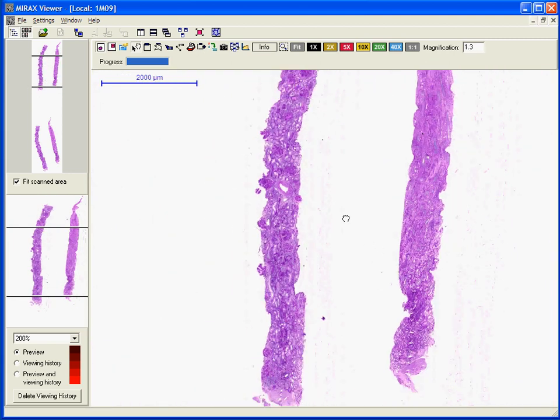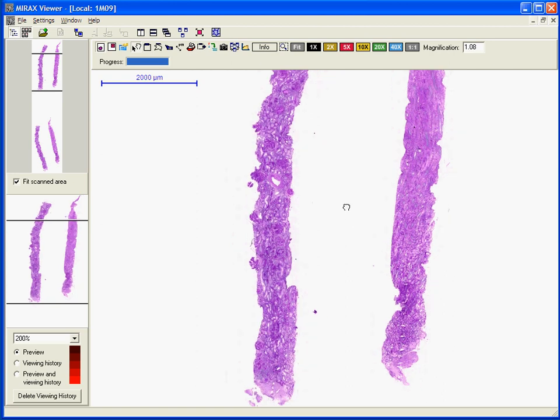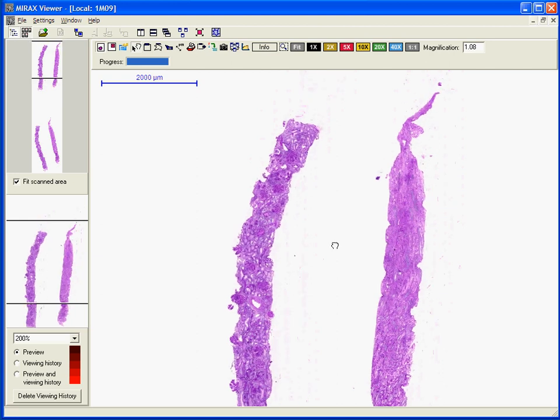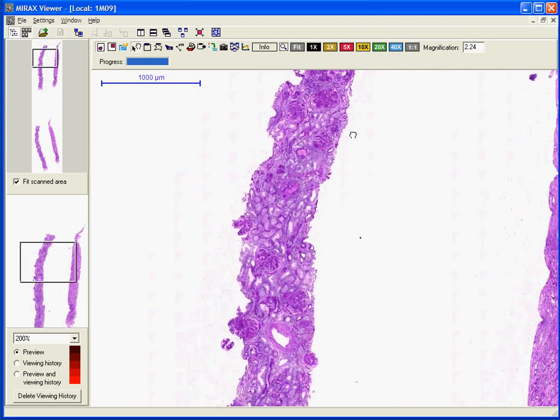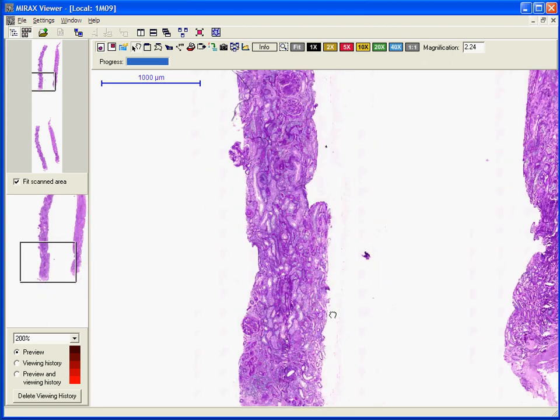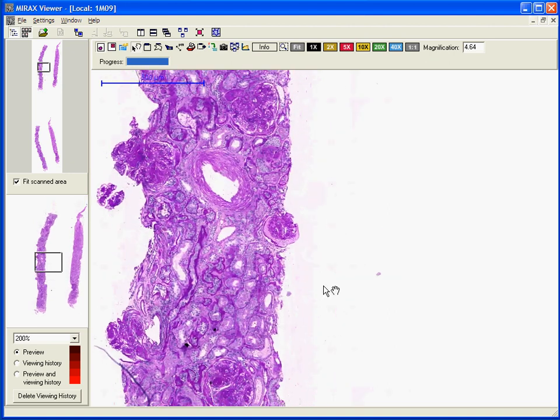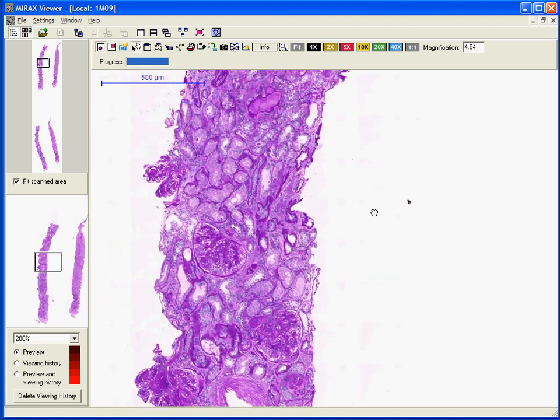In the evaluation of a kidney biopsy, we first start by localizing the injury — whether it is glomerular, tubular, interstitial, or vascular. In many cases, there are more than one compartment involved, especially in advanced stages of a disease. Our case shows involvement of three compartments; however, the glomeruli represent the predominant compartment that is involved.